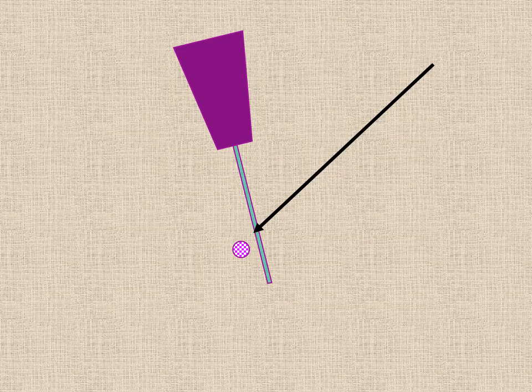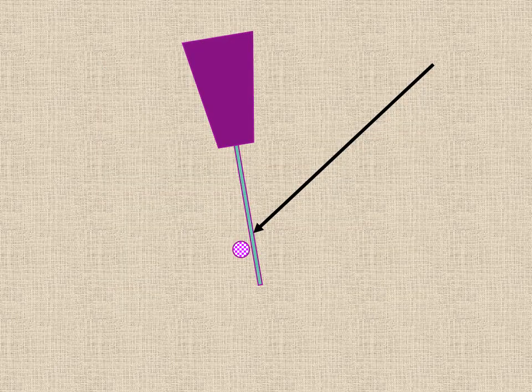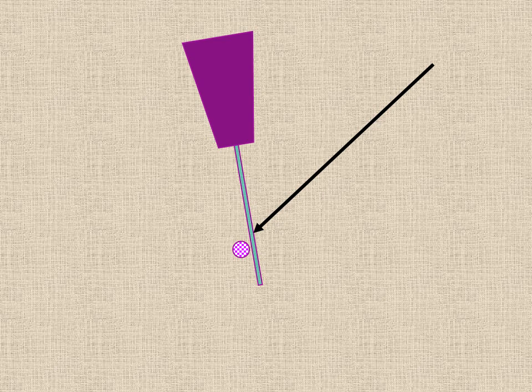If we move our beam down the shaft, it is a double dot, which is the bevel of the needle.